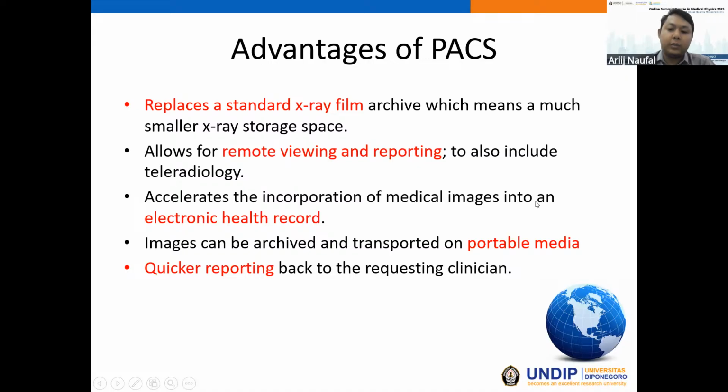Next, it accelerates the incorporation of medical images into an electronic health record. This is to migrate all paper-based recording into a digital one, for efficiency. And then images can be archived and transported on portable media. And the last one is quicker reporting back to the requesting clinician.